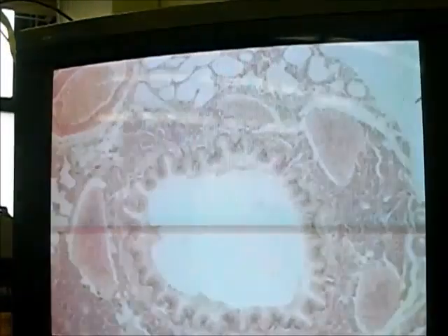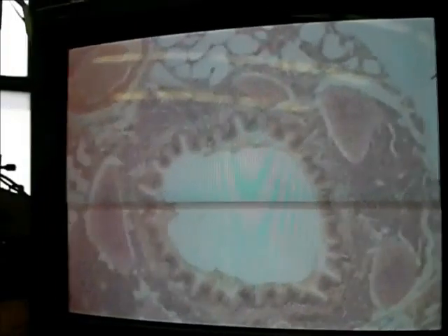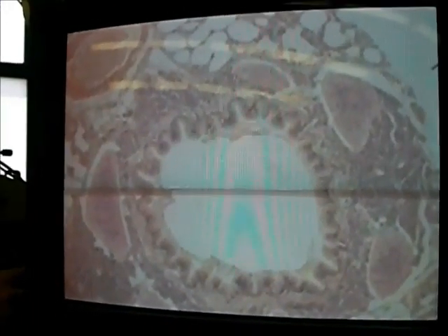Aha! What's that? Yeah, there's like a filter in it. That was the smoker's lung. I will not ask you about smoker's lung. That's why it's not on the board. I really want you to be able to identify the normal things. I think they throw that in for effect so that you don't smoke, because you see how it wrecks your lungs.